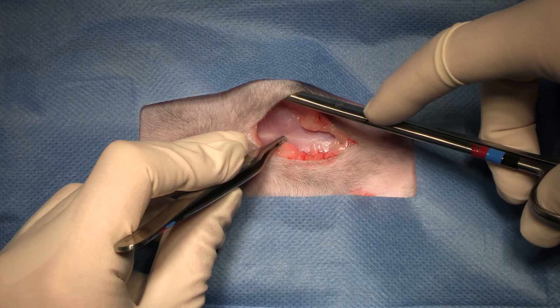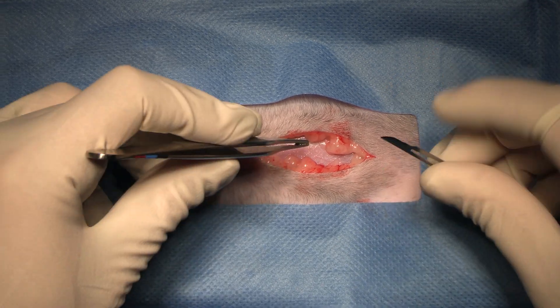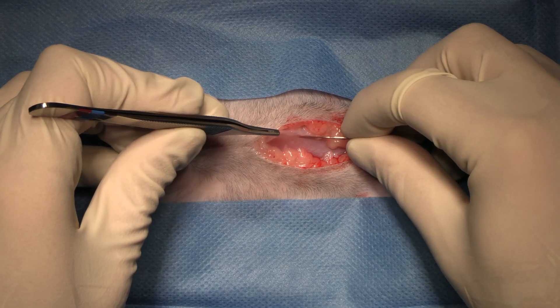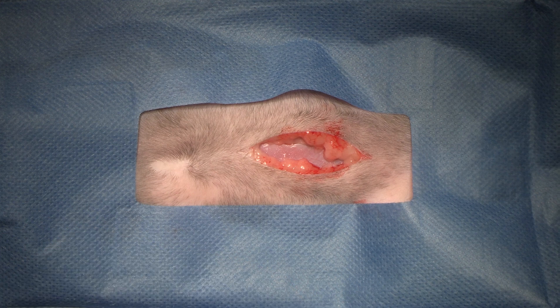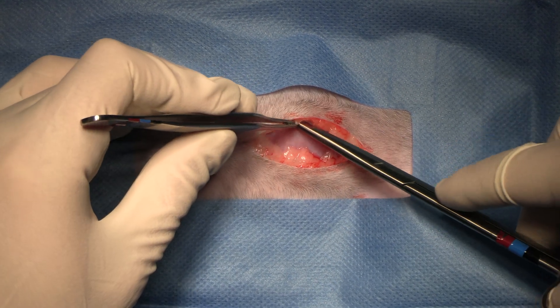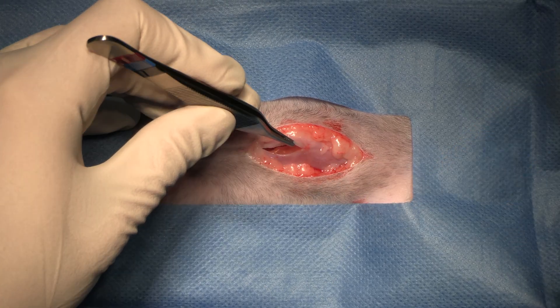Just there — very thin, not very obvious linea alba. We pick up the linea alba with our forceps and we carefully, with a blade in and up, go through the linea alba. Pop in our Metzenbaums, make sure we're through. Extend that along the length of the linea alba.